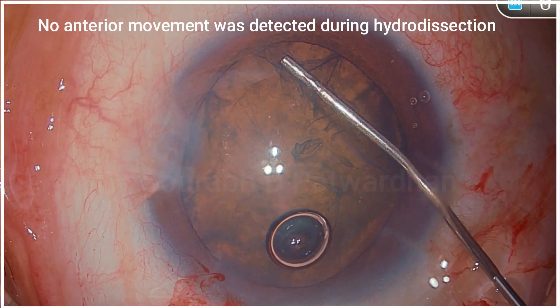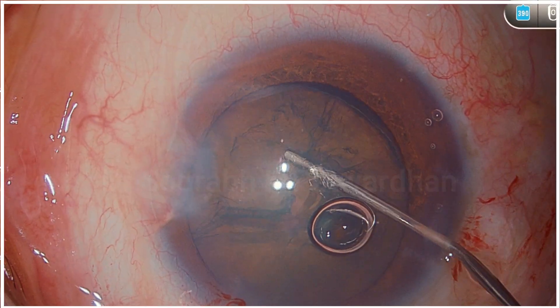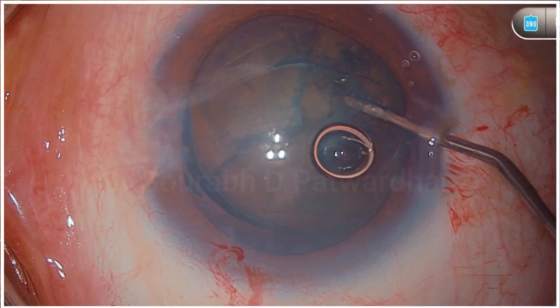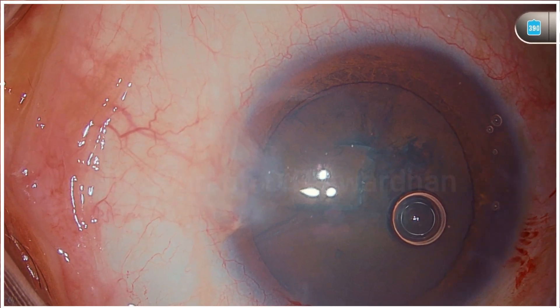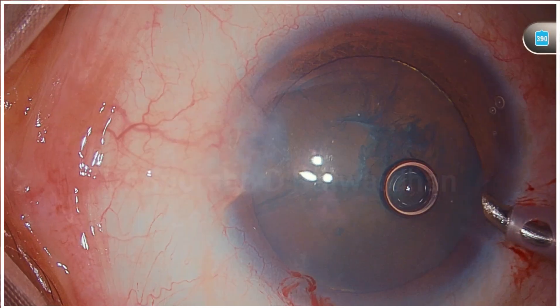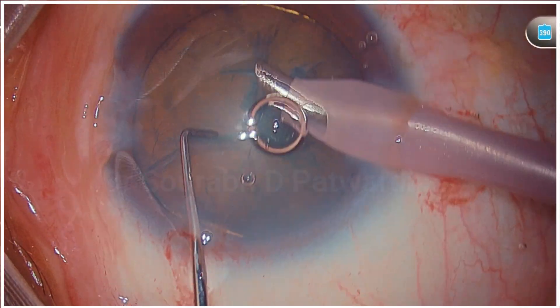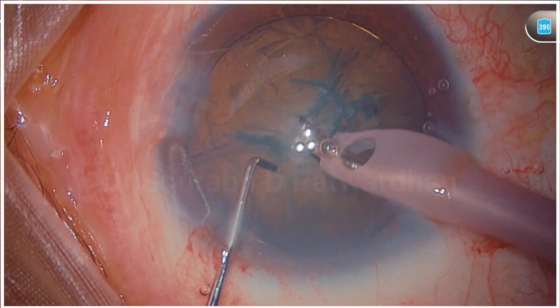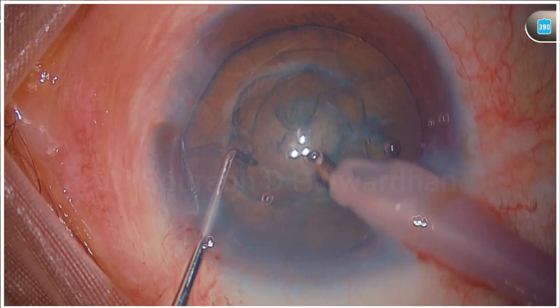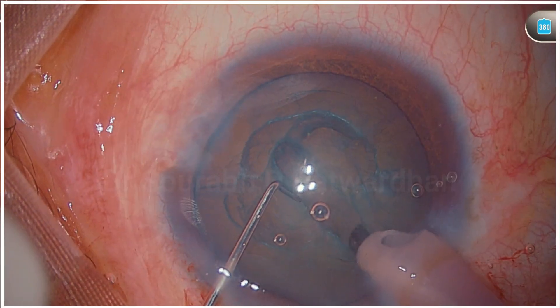Now you can see here, when I did hydrodissection, there was no entire movement of the nucleus. The hydro delineation was good, but as I tried to rotate the nucleus, it was not rotating freely. Nonetheless, I went ahead. The plan here was to make a small but deep groove — I did not want to do a wide groove, but a smaller and deep one so that I can split the nucleus into two hemi nuclei. And that is what I could do here easily.